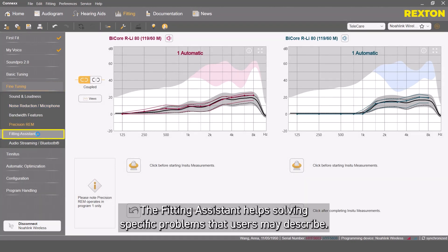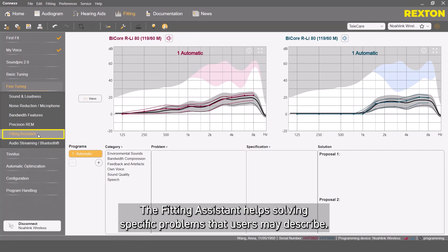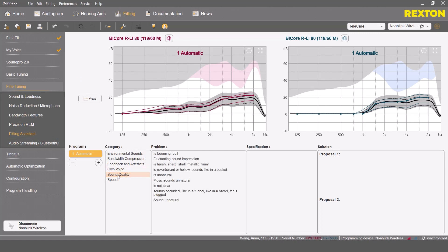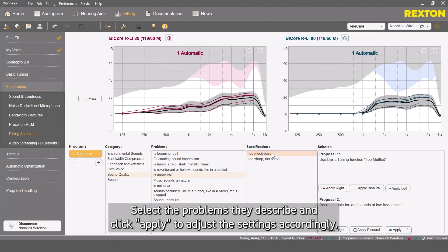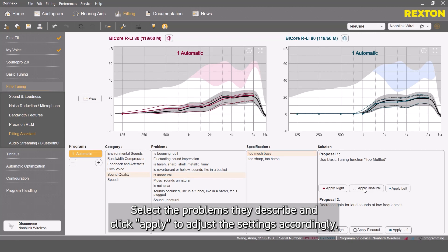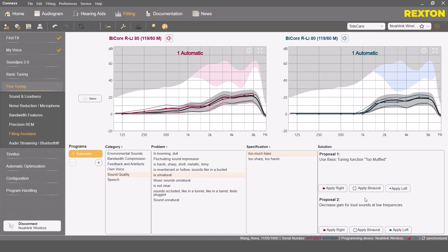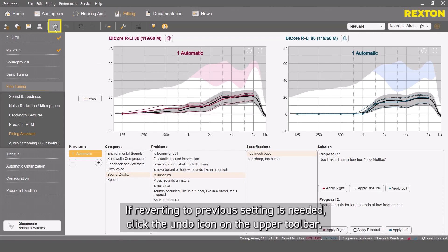The fitting assistant helps solving specific problems that users may describe. Select the problems they describe and click Apply to adjust the settings accordingly. If reverting to previous settings is needed, click the Undo icon on the upper toolbar.